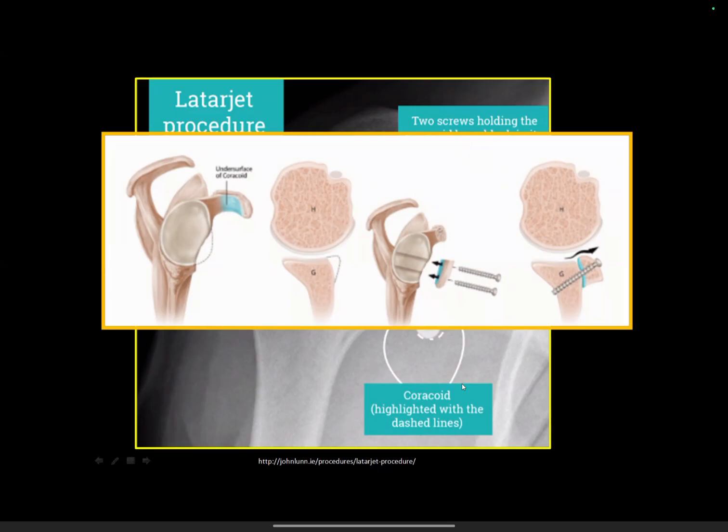So the last question for the day is, can you see a Hill-Sachs lesion without a Bankart lesion? Yes, because we talked earlier about engaging and non-engaging, right? And that's why we have to measure it. But sometimes there could be zero loss of the bony Bankart. Yes, we can see that definitely. Okay. I think that kind of sums up the Q&A as well.